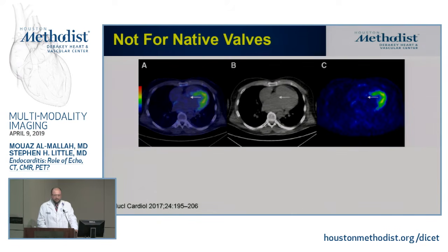I mean, the beauty of PET, once we have it, which is very soon, and we're looking forward to that, is that with any other modality, you see an abnormality, and the differential is always: is this quiescent, is this infectious, is this a thrombus, is this a post-op normal finding, particularly after major surgeries? So I think this is going to be very helpful, and I'm less concerned about native valves. I'm much more concerned about hardware.